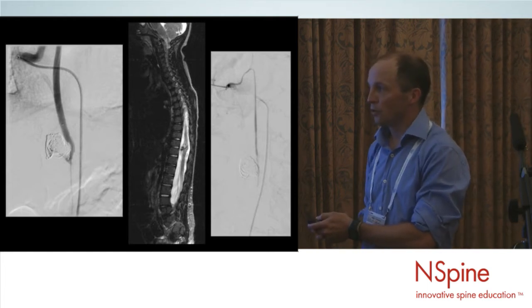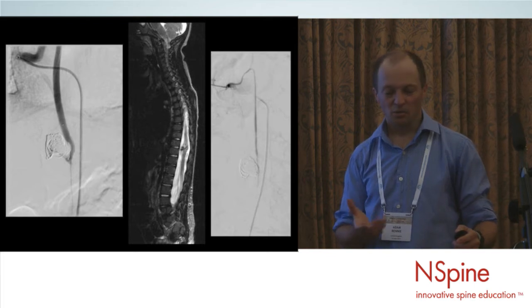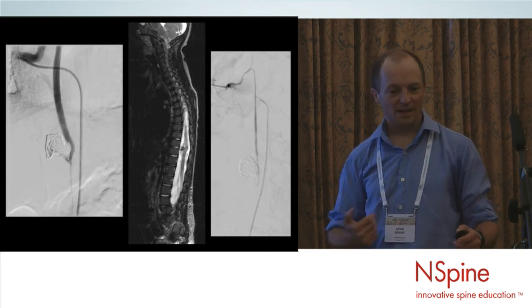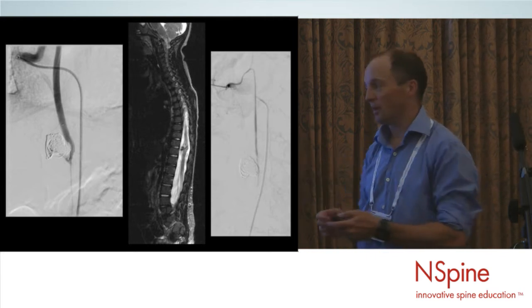By the time you've got a few coils in, and we use coils because they're easy to control, glue in this scenario is a little bit of risk. With such high flow, you're not plugged or wedged in the artery, it can get whisked away very quickly, or you can inject too fast and you'll be up into the anterospinal axis.